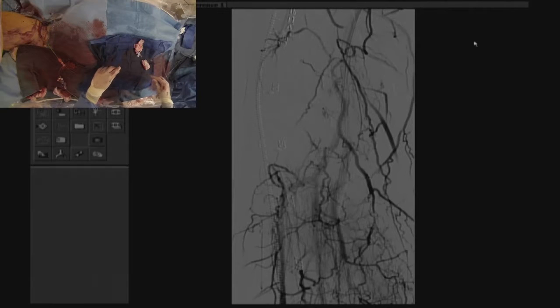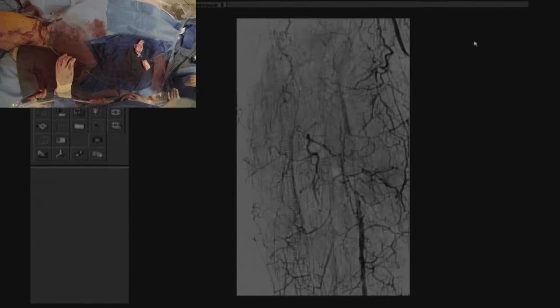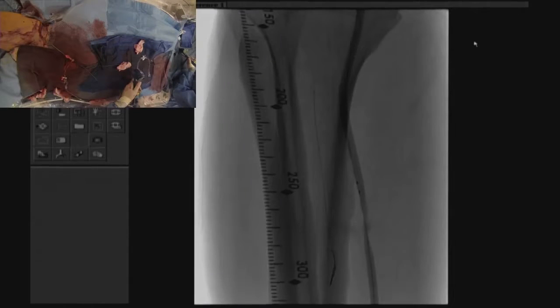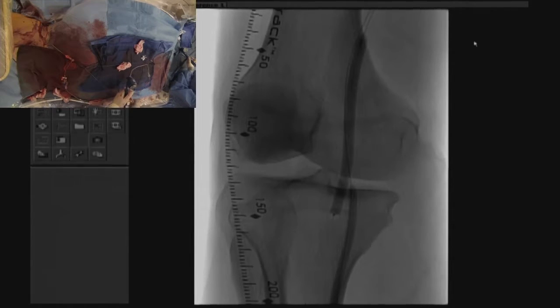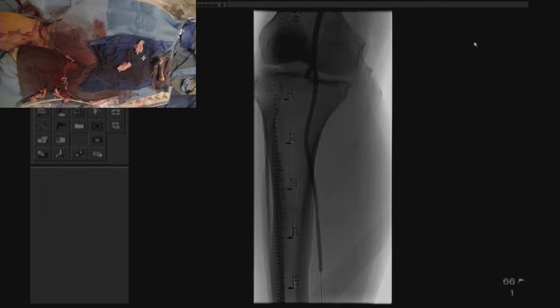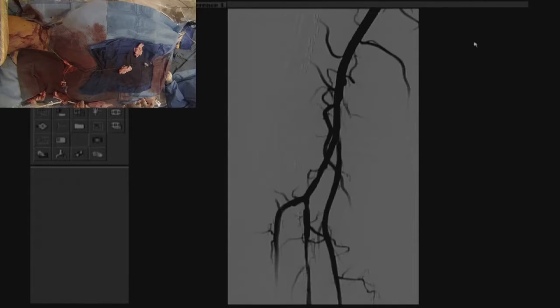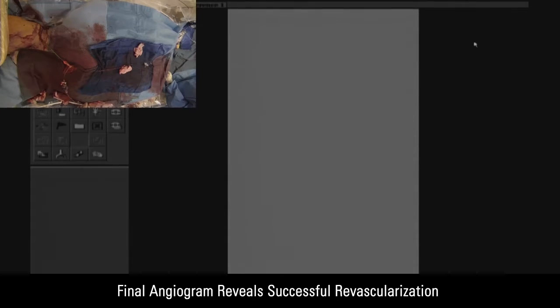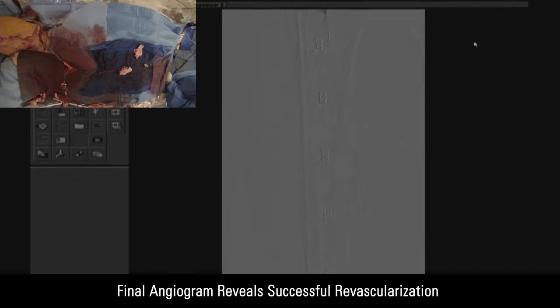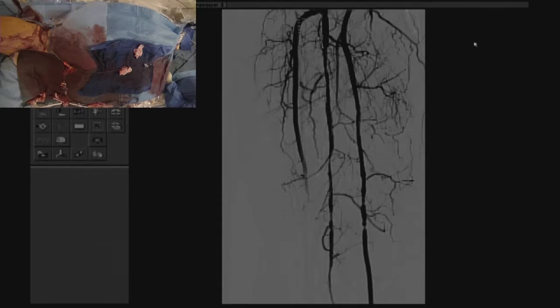You can see the antegrade blood flow. We can see that there is some spasm within the posterior tibial artery, and we will proceed with low-pressure balloon angioplasty within that segment. A word of caution about sizing for these vessels — it might come as a surprise to many that the posterior tibial artery was ballooned with a 4 mm balloon, and the TPT trunk and popliteal artery were ballooned with a 5-6 mm balloon. We performed kissing balloon angioplasty for the popliteal and posterior tibial artery.